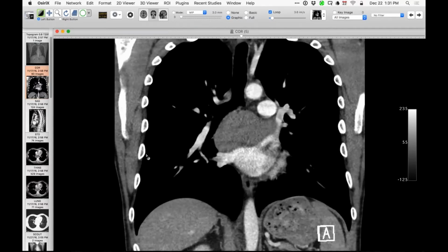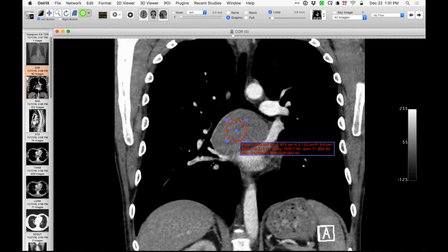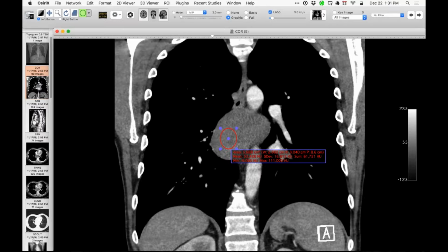Howard, what sort of CT numbers did you get out of it? Yeah, let me do it again here, Dave. The 40s, 50s, around there. You're in the 50 range. Wow. 45. I wonder if it had bled and there were some blood products in there giving it that higher density. Yeah, I don't know. Or just mucus. I've even seen them calcify sometimes. The mucus can calcify. So it's probably pretty proteinaceous, I guess, with a tumor like that.